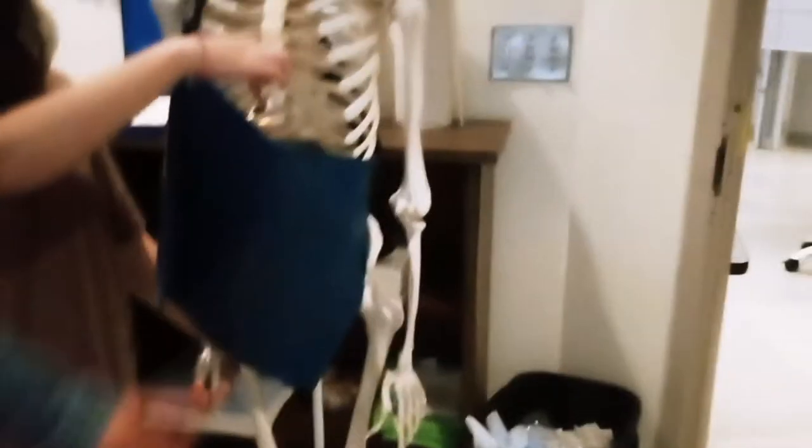We've got image receptors set up. This one appears to be eight feet away from the patient. We've got some more in the corner. I've got this one behind the left. Excellent.